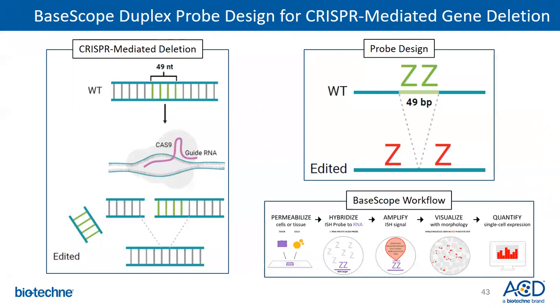On top of that, I can see how the software can say, okay, here's the average dot per nucleus, and that's really what I'm getting into. And then how do you determine in cell types? If you've got a non-small cell lung cancer, you're going to have a lot of different cell types in that tumor. So how are you assigning dots?